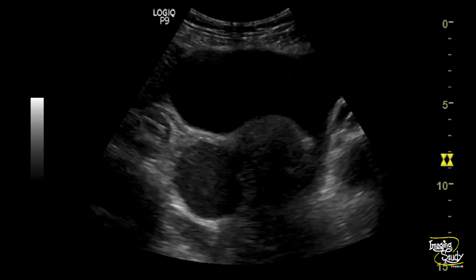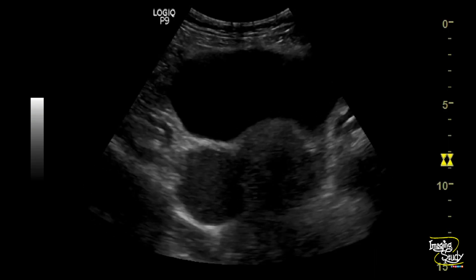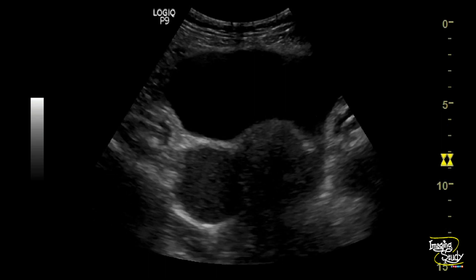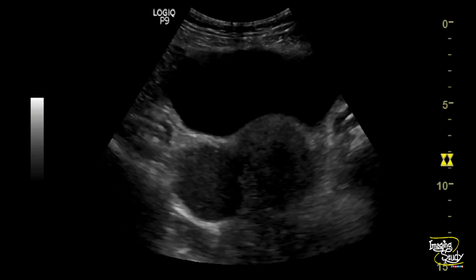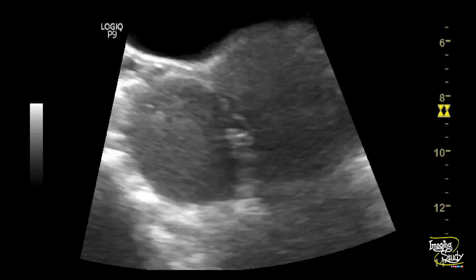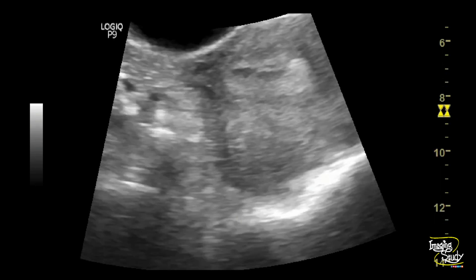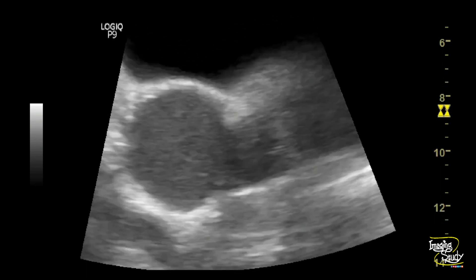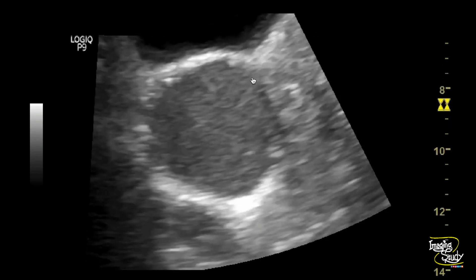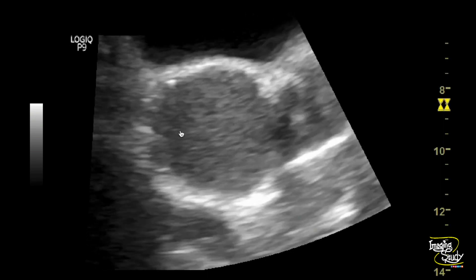The right ovary could not be separately visualized here. Let's magnify the image — you can see the homogeneous pattern of this area, which goes in favor of endometrioma.